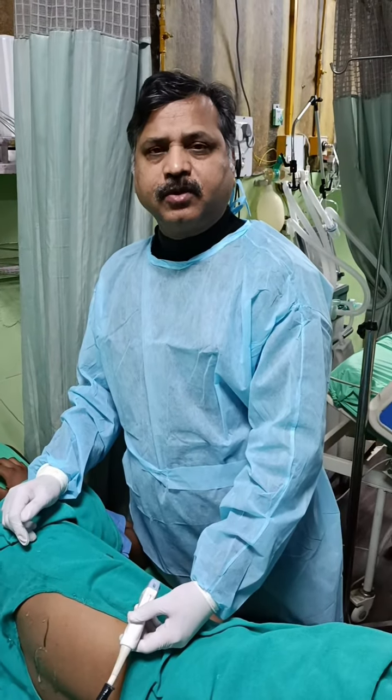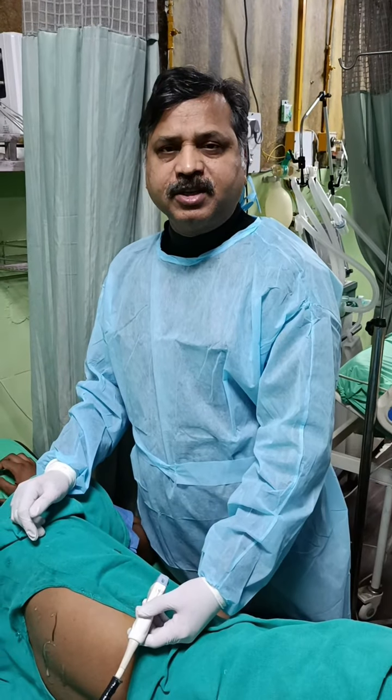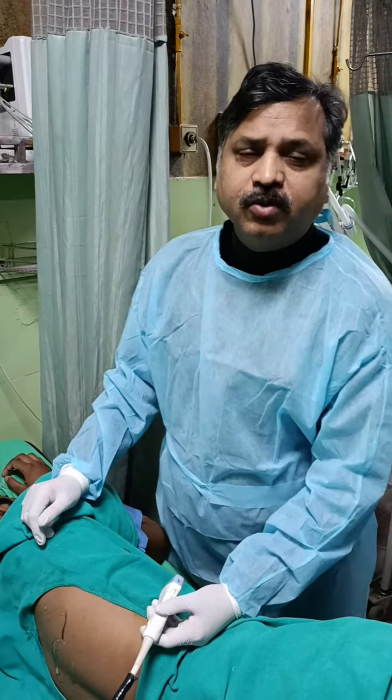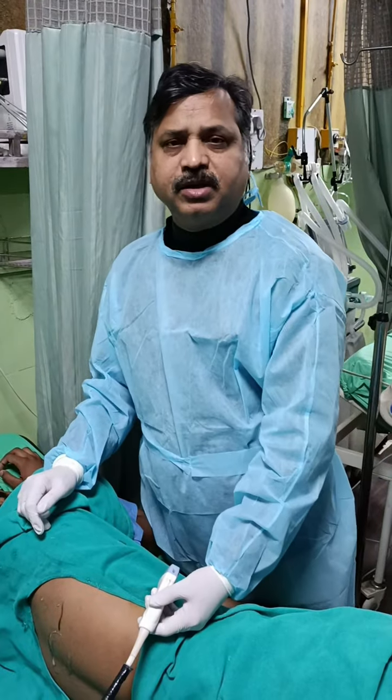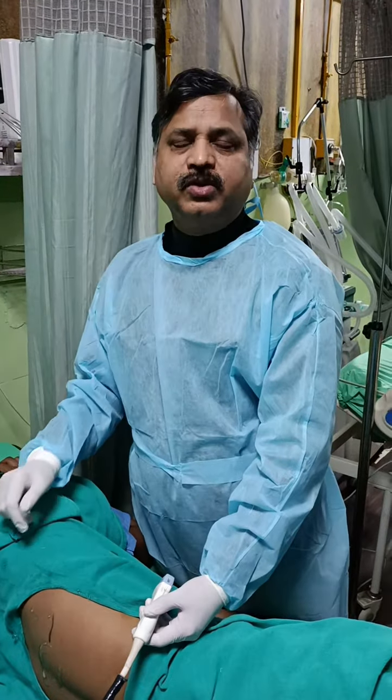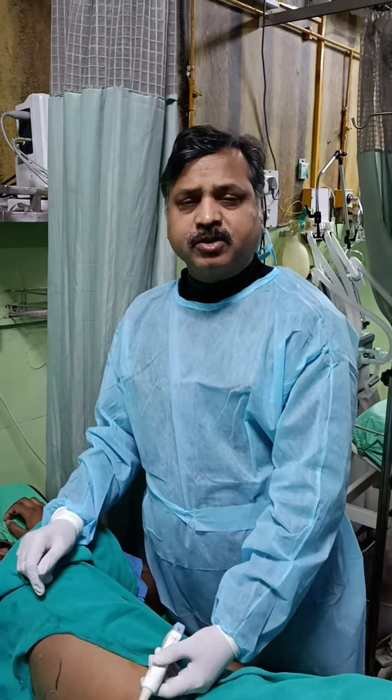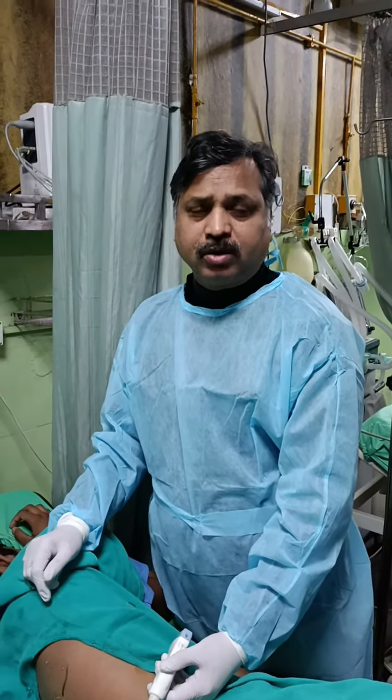Hello, I am Dr. Amar Chon from Burmary Singh Hub and today I am going to demonstrate how to do an erector spinal plane block.